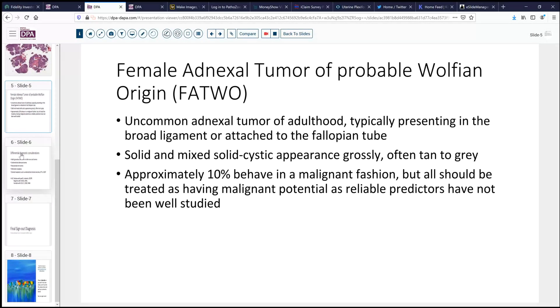And so we were led to the diagnosis of female adnexal tumor of probable Wolffian origin. This is an uncommon adnexal tumor that occurs primarily in adulthood, over a very broad age range, and typically presents in the broad ligament or attached by a pedicle to the fallopian tube. It does tend to have this solid and mixed solid-cystic appearance, often tan-gray in color on gross evaluation. Microscopically, it has these cords and sieve-like pattern of solid, sometimes spindled and epithelioid cells, which are generally quite low grade. However, up to 10% will behave in a malignant fashion, although this is based on a relatively small number of reported cases — around 100 or so — so we don't have well-developed indicators of malignant behavior.